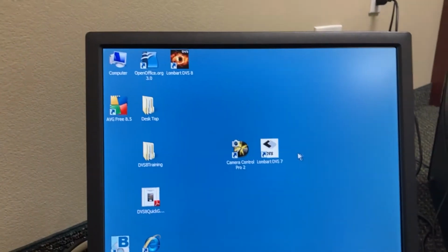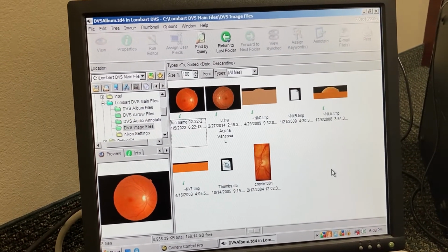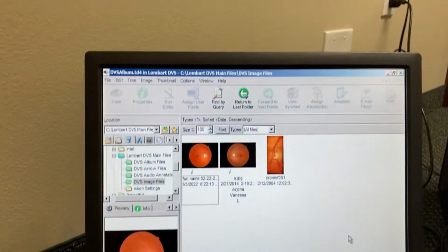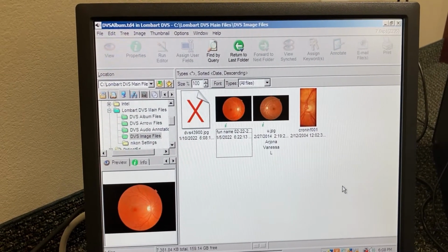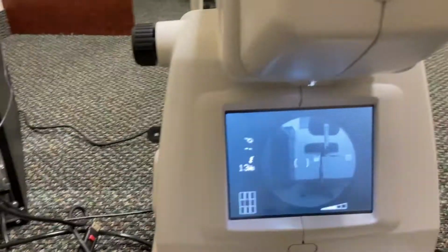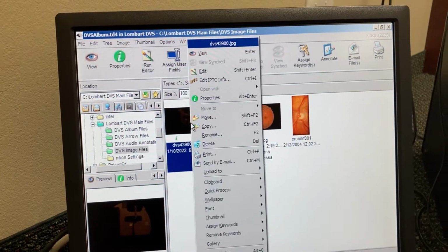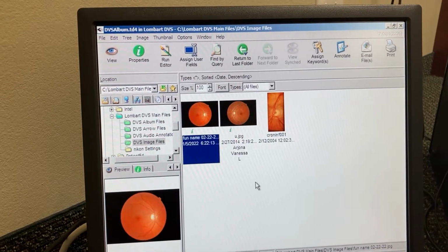Then we can open up the original file folder like we'd wanted to, and let's see, it will take. There's our new picture. Fun. Let's open it up and see what it looks like. It's the chair, just like it took. Yay. So now we know that it works. Boop. Gonna get rid of that one. And then see if we can delete. Okay. Yes. Got rid of it.